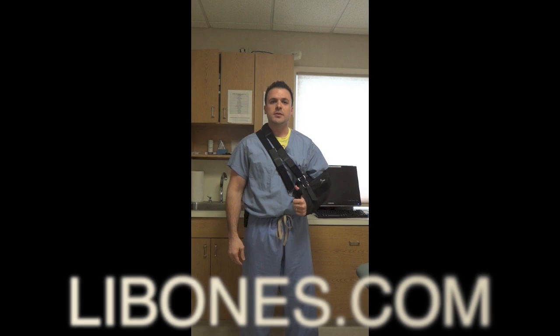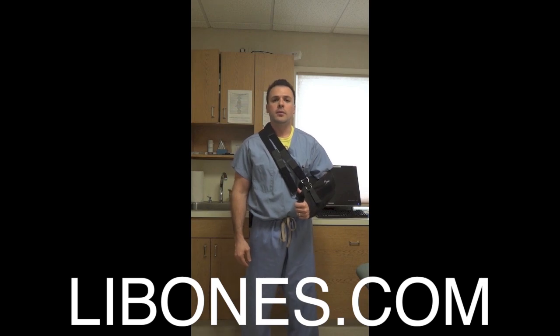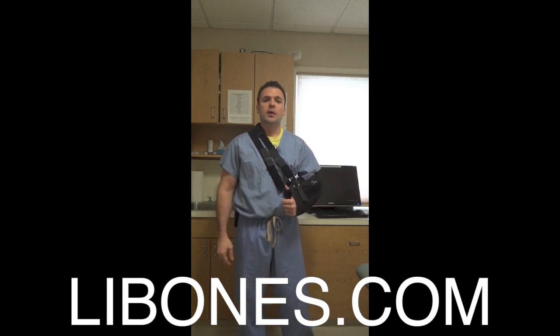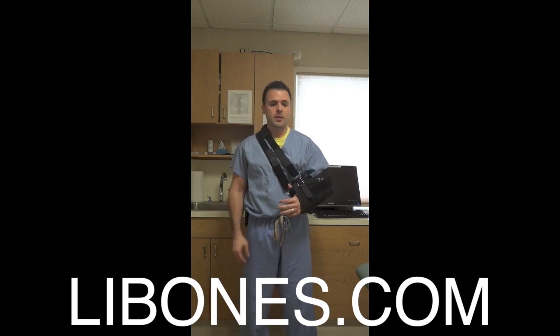Hi, I'm Charlie Ferrer, one of the PAs for Long Island Bone & Joint. I'm showing you how to use an abduction sling after your shoulder procedure. This is how it's properly positioned after the shoulder arthroscopy.